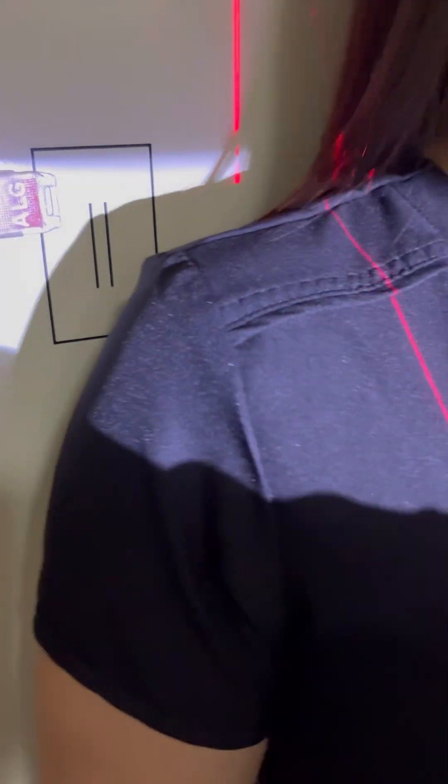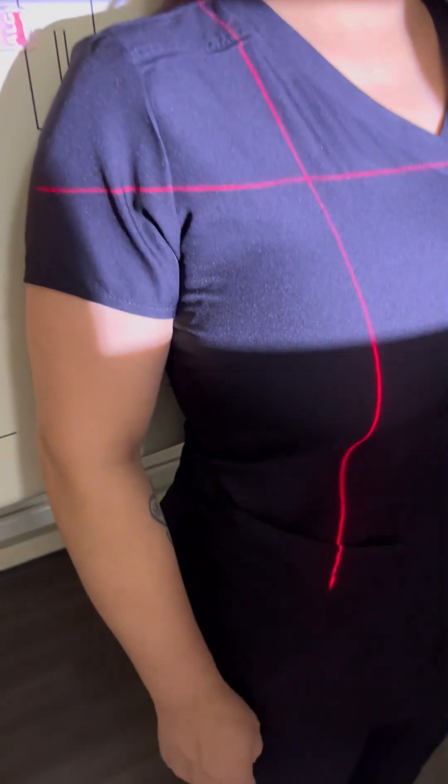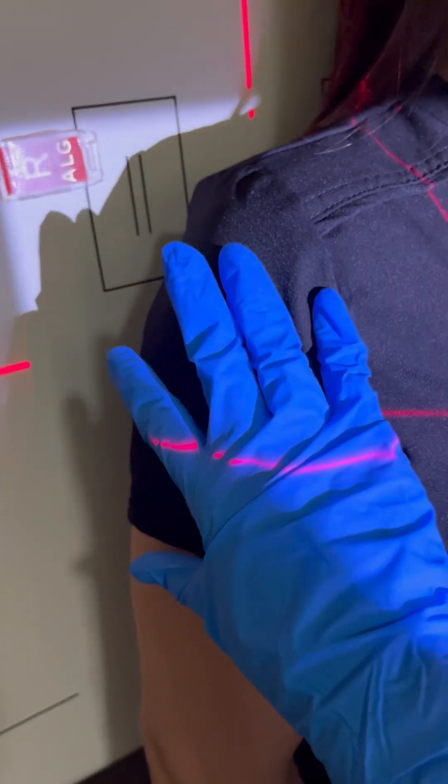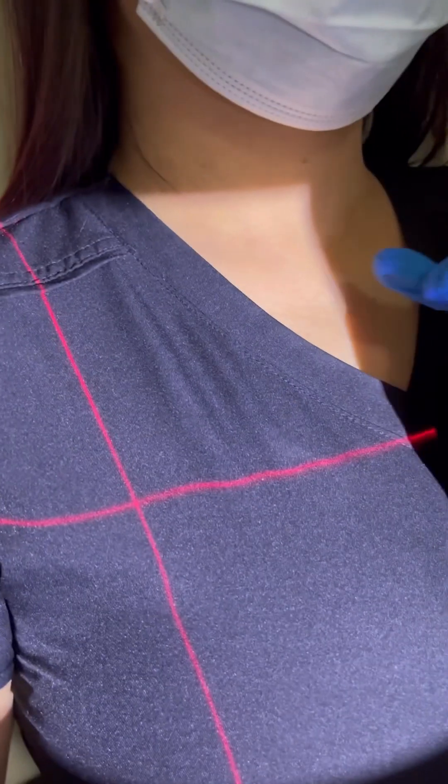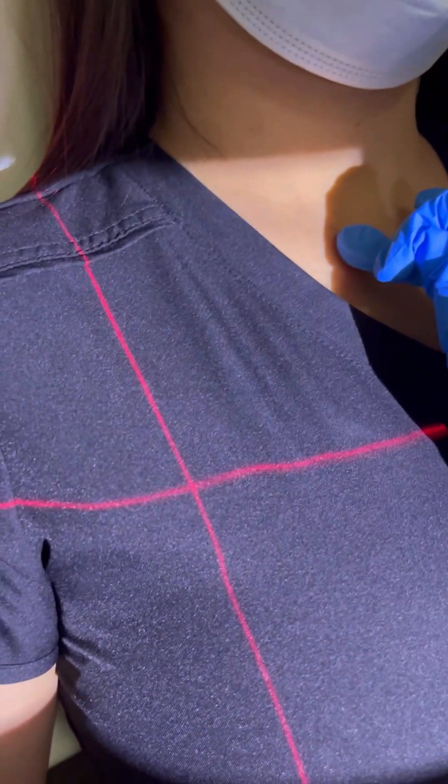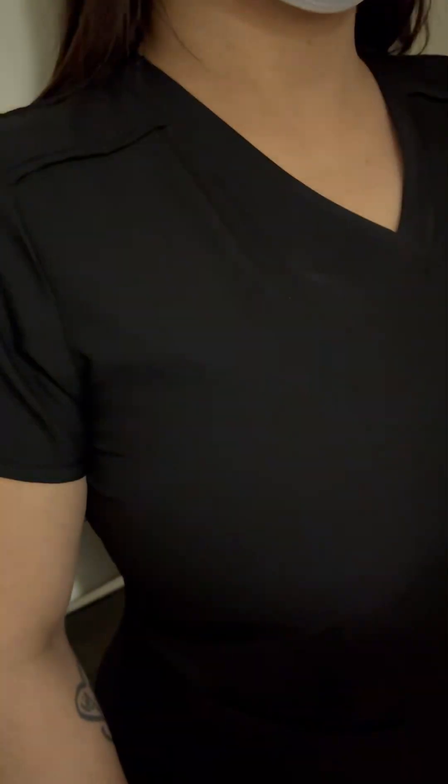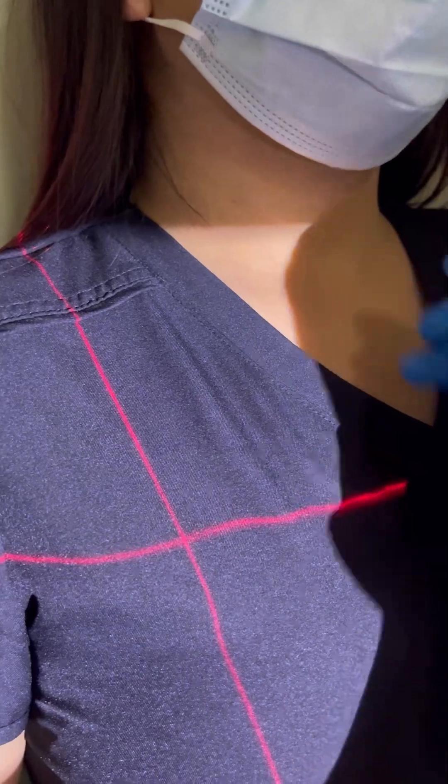I'm going to have you stand so that your back is totally over to the board. You want to try to get the skin margin, and then you also want to try to get that side of the clavicle. You don't have to get the other clavicle, just the entire clavicle.